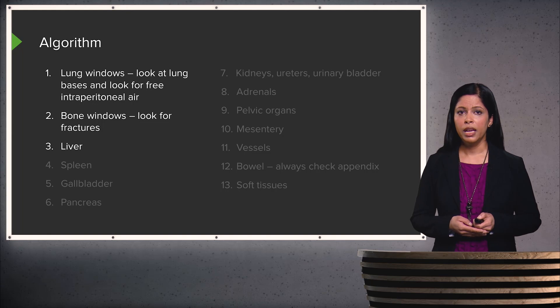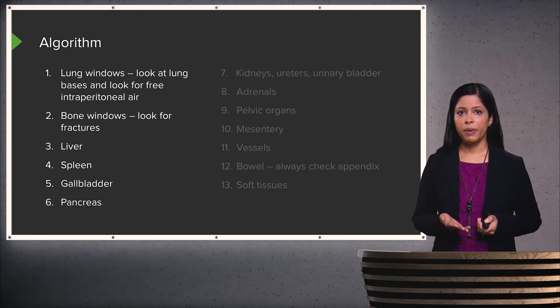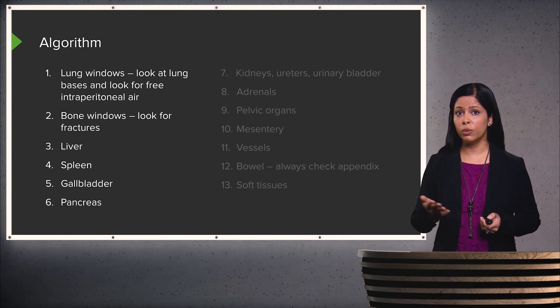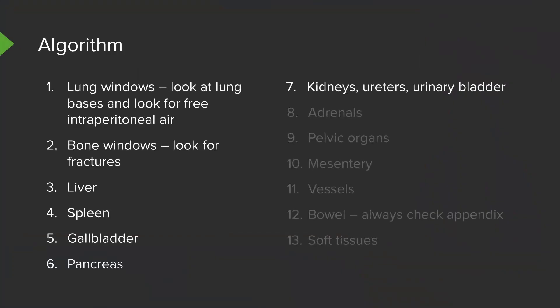I then take a look at the liver, scrolling multiple times through it. I then go on to the spleen, the gallbladder, and the pancreas — scrolling through each multiple times before moving on. I then look at the renal collecting system and the kidneys, the adrenal glands, and then all of the pelvic organs. I then evaluate the entire mesentery, the blood vessels, and the entire bowel. Always check the appendix — even in a patient not presenting with abdominal pain, because you may find occult appendicitis. I then take a look at all of the soft tissues.